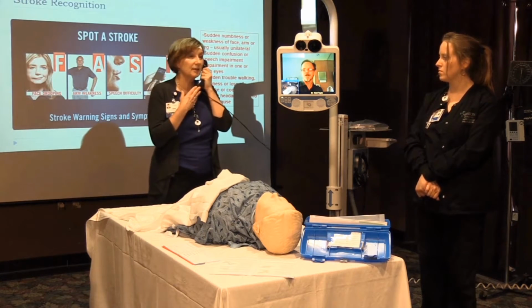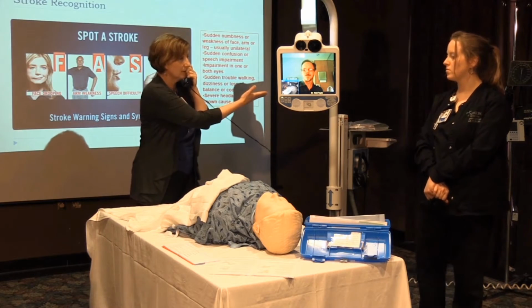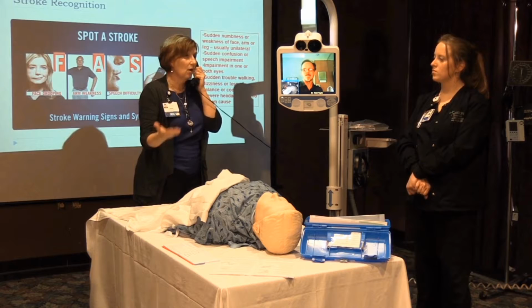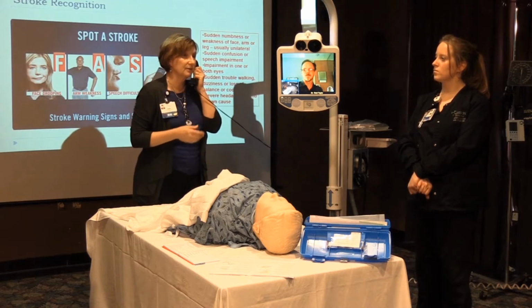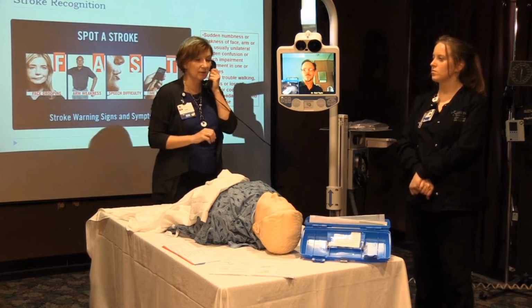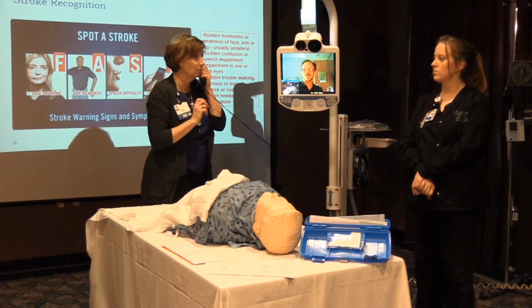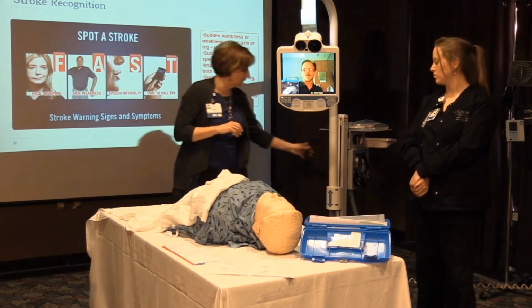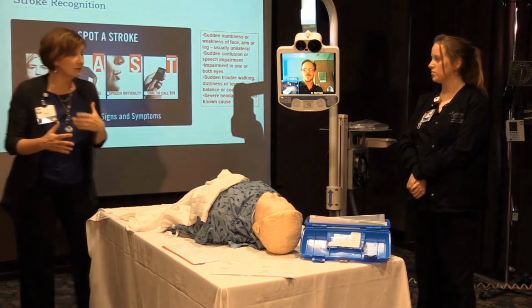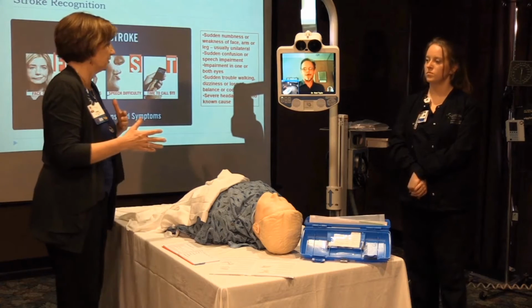So the handset can be used if the telestroke provider wants to speak directly to the family or with the ED physician. There can be consultation even while the telestroke doctor is still in the room, and that may help facilitate some of the transport decisions and conversations.